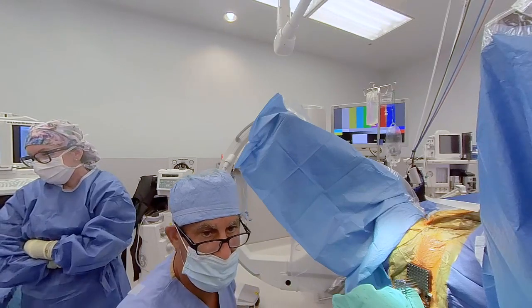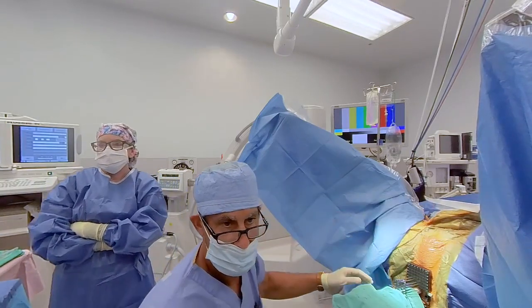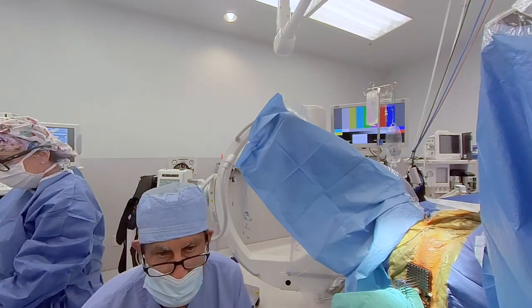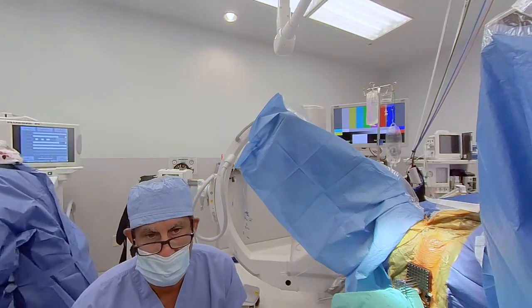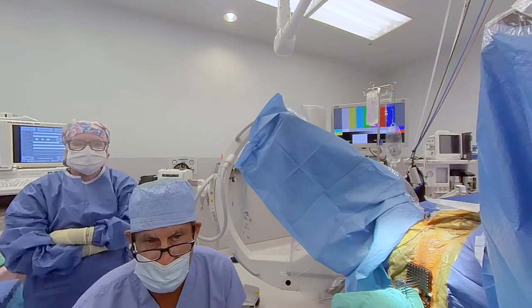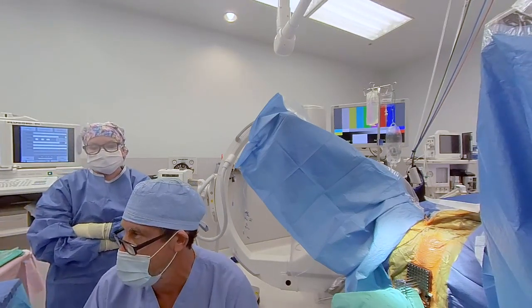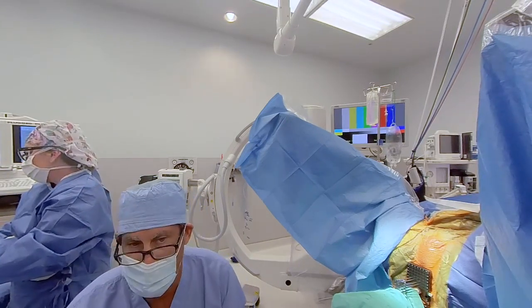Okay. Let me know when you're ready for needles. While you've been perfectly positioning your needles, physicist Avi has been contouring and getting a rough definition of the prostate and prostate gland. Yeah, so it's sort of like layering two procedures onto one at the same time so that you improve efficiency and decrease the time. We don't find that much change in the prostate volume if it's done quickly. Obviously, if it takes a long time, you're going to get some intraprostatic swelling, which changes the volume to some extent by the time you implant it, but that's expected and built into the procedure.